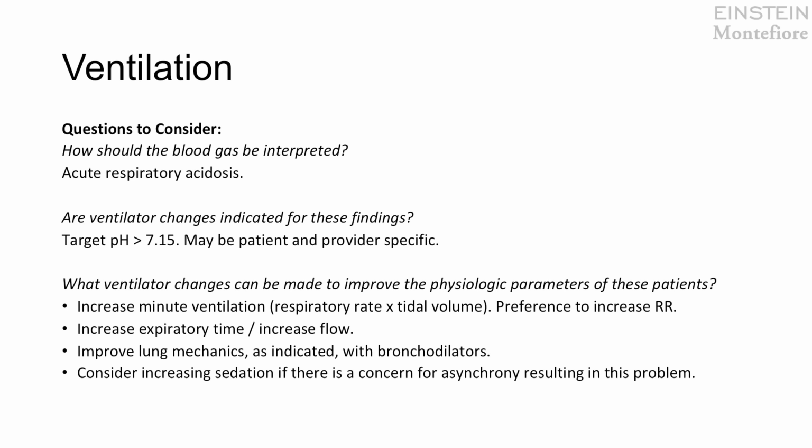Additional things that have been done and advocated for at times are administration of bicarbonate or increased tidal volumes. But as we talked about, at least increased tidal volumes are not advocated for, and administration of bicarbonate often leads to fluids, which is generally thought to be injurious in patients with ARDS. So the primary thing to do would be to increase the respiratory rate.